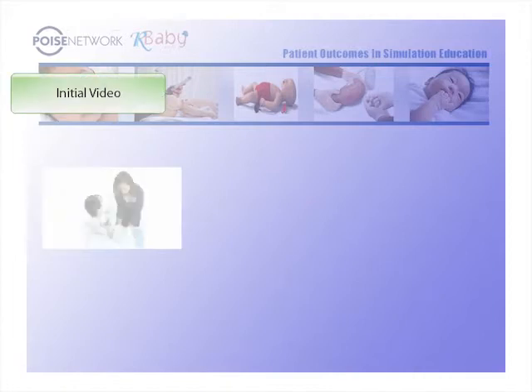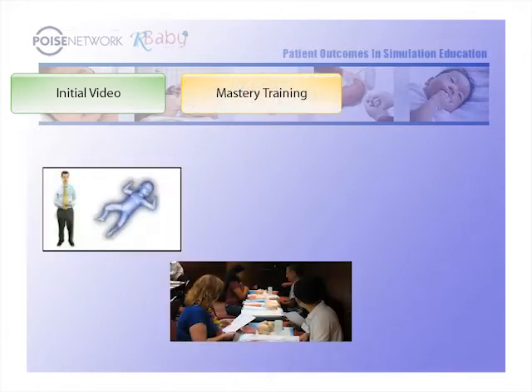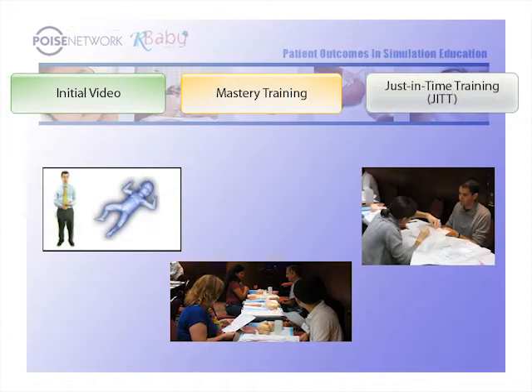Prior to arrival, interns will view a procedural training video outlining the steps in the infant LP procedure. Then, towards the beginning of the year, they will experience a hands-on learning session using a simulator with you as the facilitator. Finally, prior to any clinical encounter, the intern will have a just-in-time refresher training on the simulator. Interns will be assessed for competency throughout this training experience, and clinical performance will be collected.